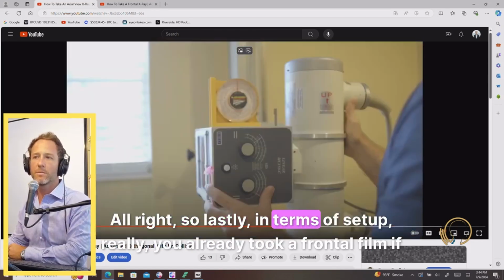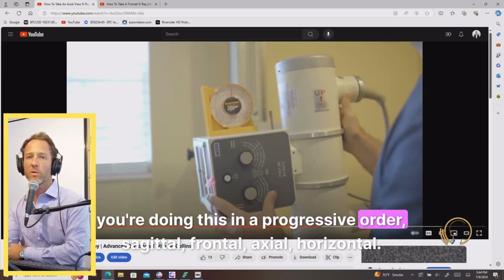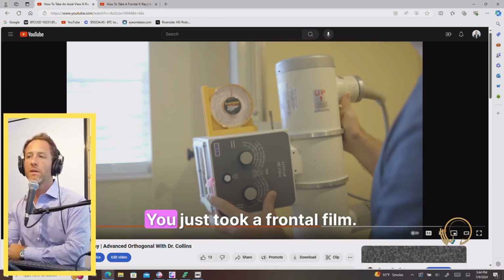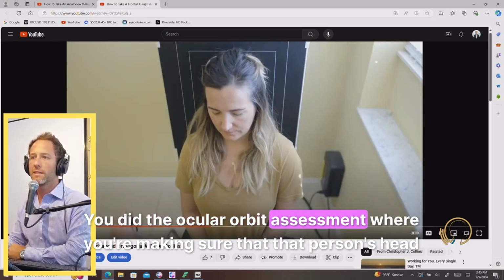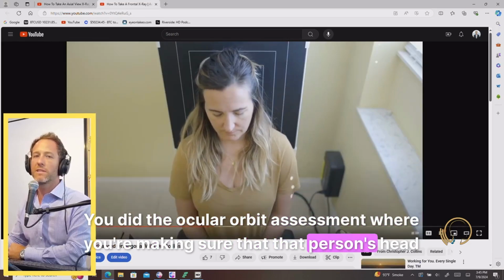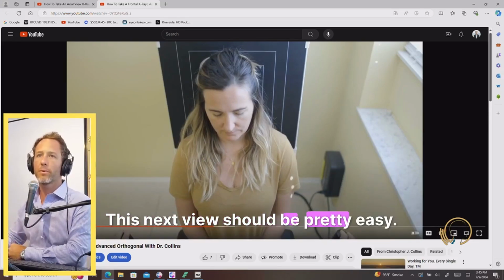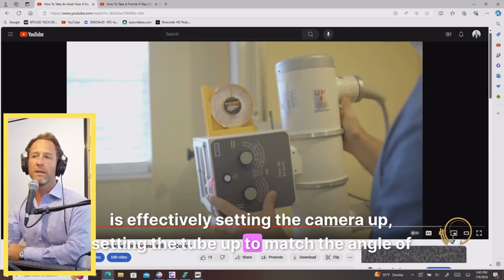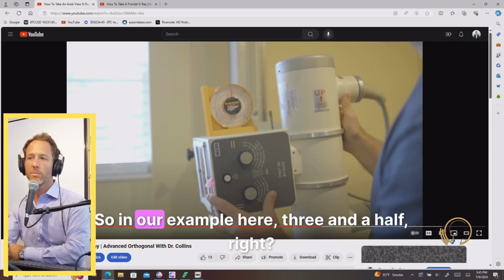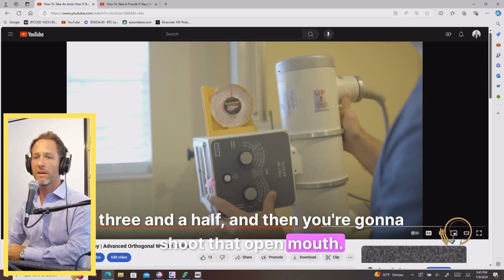All right, so lastly, in terms of setup, if you're doing this in the progressive order, sagittal, frontal, axial, horizontal, you already took a frontal film. You just removed all the rotation. You did the ocular orbit assessment where you're making sure that the person's head is looking at you symmetrically. You took that frontal film, it was perfect. This next view should be pretty easy. What you're doing now is effectively setting the tube up to match the angle of that George's line. So in our example here, 3.5, right? You're taking it from the 14 degree S line you just took, bringing it more shallow to 3.5, and then you're going to shoot that open mouth.